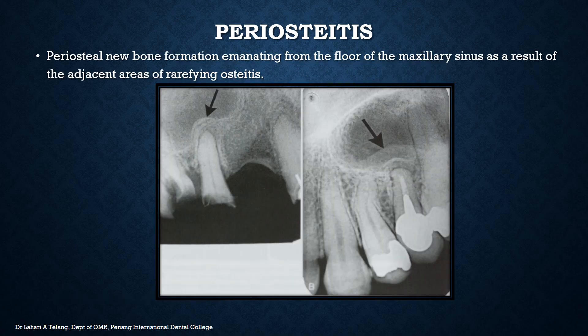Periostitis is a new bone formation emanating from the floor of the maxillary sinus, seen as a result of adjacent areas of rarefying ostitis. Both images here show maxillary premolars with roots very close to the maxillary sinus floor. As a result of inflammatory reaction at the apex of the premolar, the mucosal and periosteal lining on the floor of the maxillary sinus also gets inflamed, leading to more bone formation there, and in some cases mild mucositis as well. This reaction, called periostitis, is very commonly seen in the maxillary premolar and molar regions.